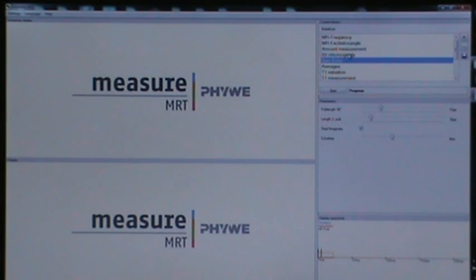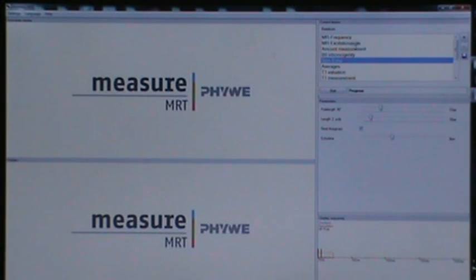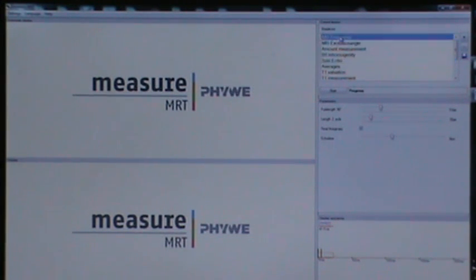Second, select the experiment called MR frequency from the experiment section. Start the measurement.